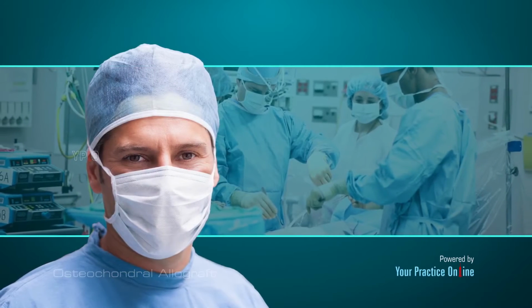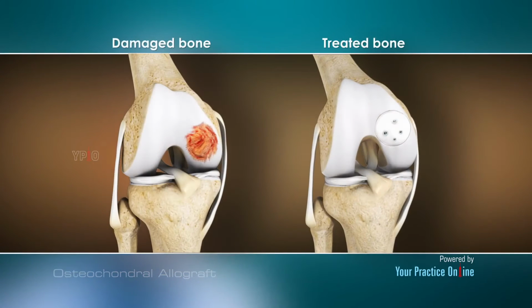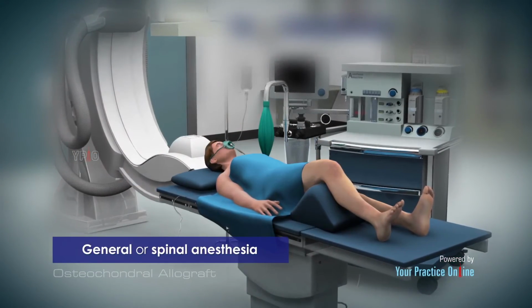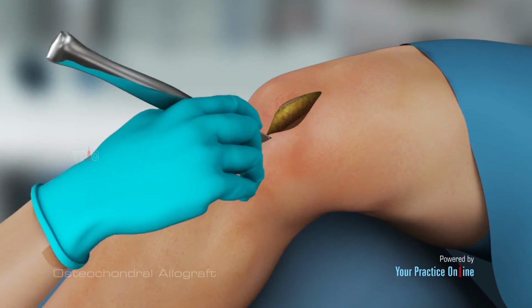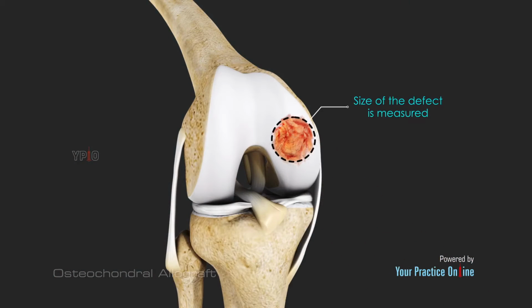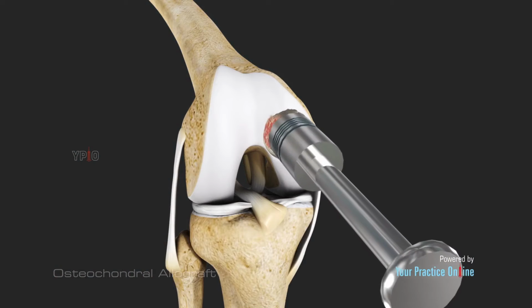Surgical procedure. The implantation of osteochondral allografts is usually performed through an open incision under general or spinal anesthesia. An incision is made to expose the joint defect. The size of the defect is then measured, and a portion of the cartilage and underlying bone is removed.